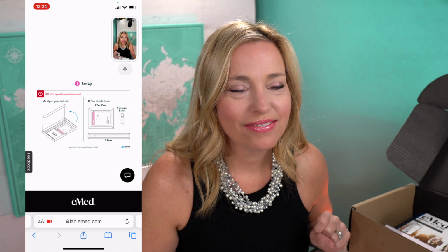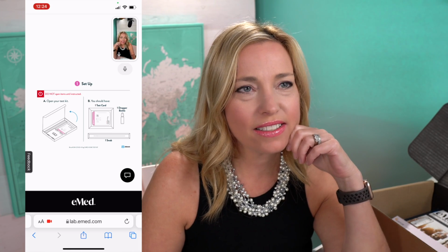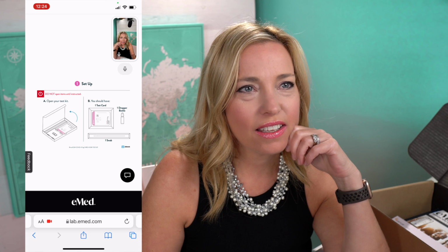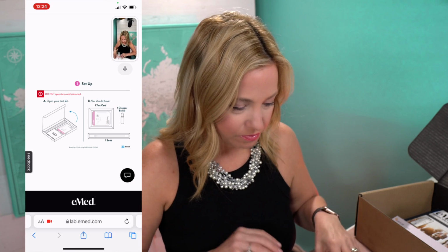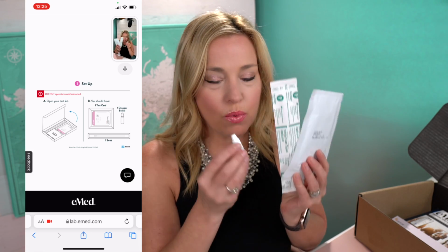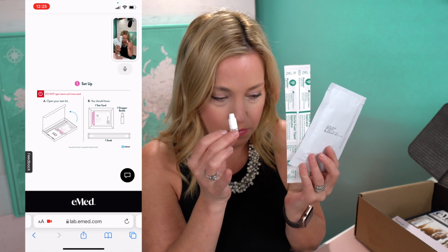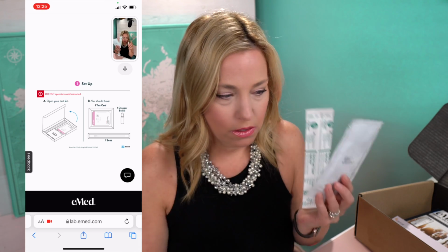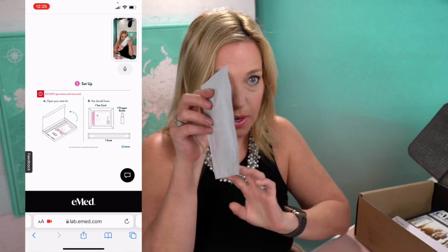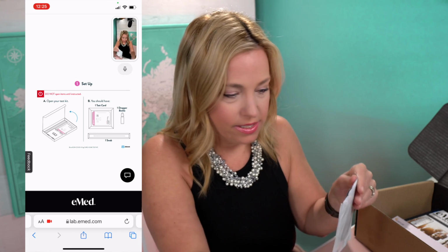Hi, I'm back. Can you hear me better now? The quality went down a little bit, but you sound a little bit louder. Yes. Okay, perfect. So there's supposed to be 3 items: a swab, a white package, and a bottle. Can you see them? Yes, I have all 3 items: a swab, a wipe package, and a bottle. Okay, perfect. Please open the white package. The white package. Open this one. Yes, in one of the corner there is a notch. Great, I see the notch.